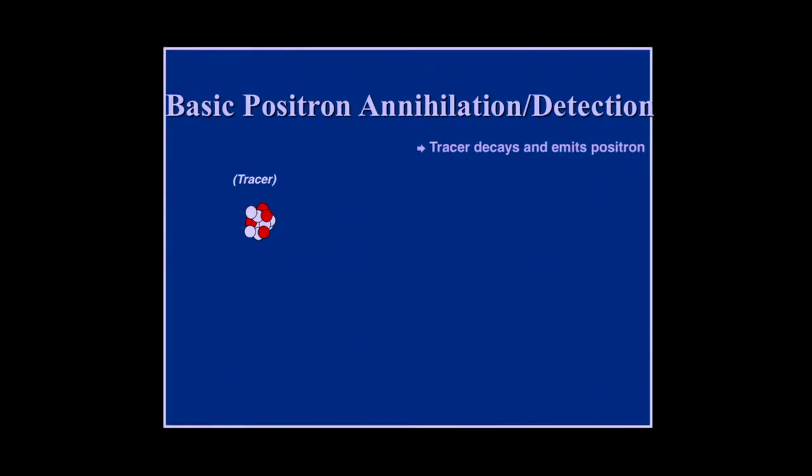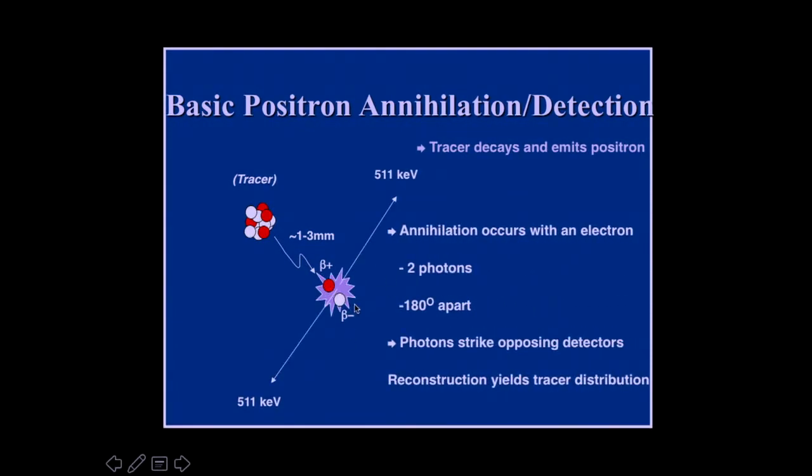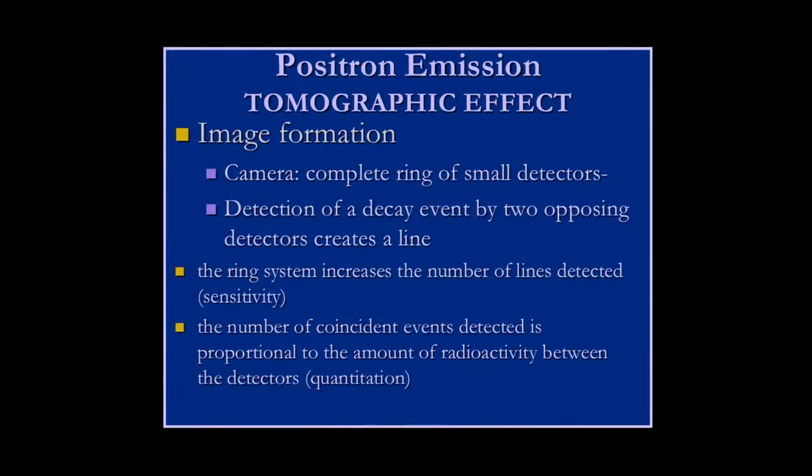Now, when we design equipment, it has to function based on what the particle emits. So with positron emission, you get this positron, a positive beta particle or electron, and it hangs out for a very short amount of time and hits a friend, a negative beta particle, and emits these two X-ray beams, I should say gamma rays, at 180 degrees apart, 511 keV, very energetic. So now, to see these properly, I need detectors on either side at the same time so I can catch those guys at the same time.